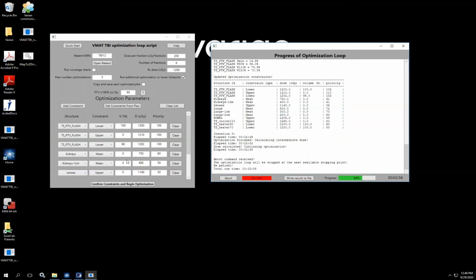And Peter, it's fast because this is a modified version of the algorithm. So it's not actually doing dose calculations or anything like that. No, if I had figured out how to make it go that fast, I'd sell that and then just retire early. But what it's doing is, instead of actually doing the dose calculation, it does a thread sleep function for 3 seconds. So as I was saying, the processors controlling this script have no idea what's going on inside of Eclipse.